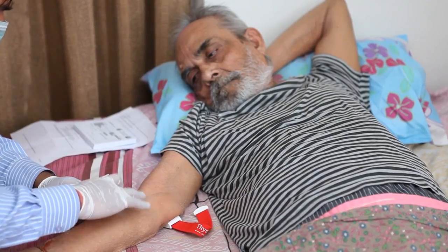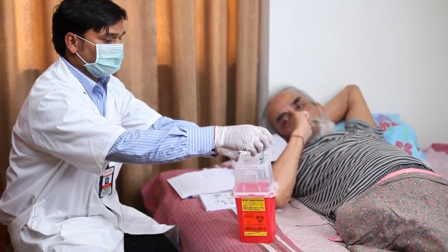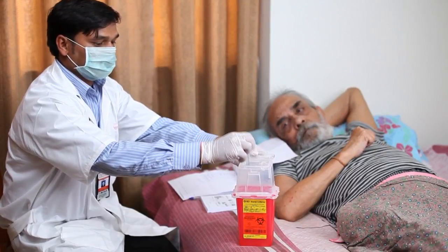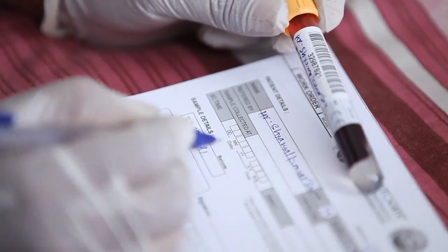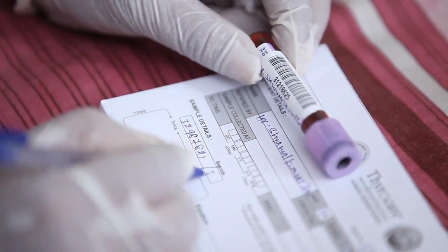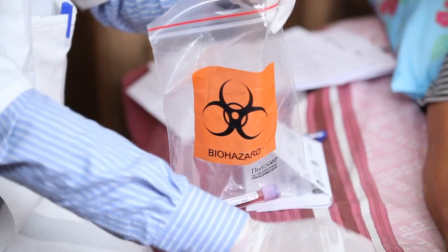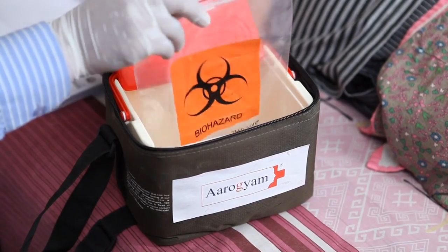After removing the cotton swab, stick a spot plaster. Discard the needle into the puncture-proof container having 1% diluted sodium hypochlorite solution. Care should be taken to record the identity of the beneficiary on the vials, particularly if samples are collected from more than one person. Place the sample vials in Ziploc packets to carry them in cool packs to the collection center.